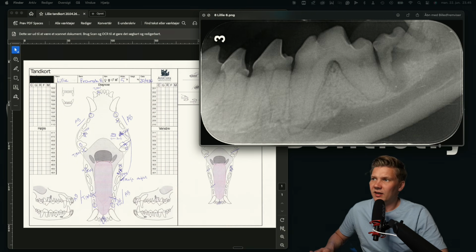So the next picture is getting some of the premolars, and they look fine, except that we also have some abrasion. You can see they seem quite flat here, and so you just note AB, abrasion. I did note G2, which is gingivitis, and some fusion of one of these roots.